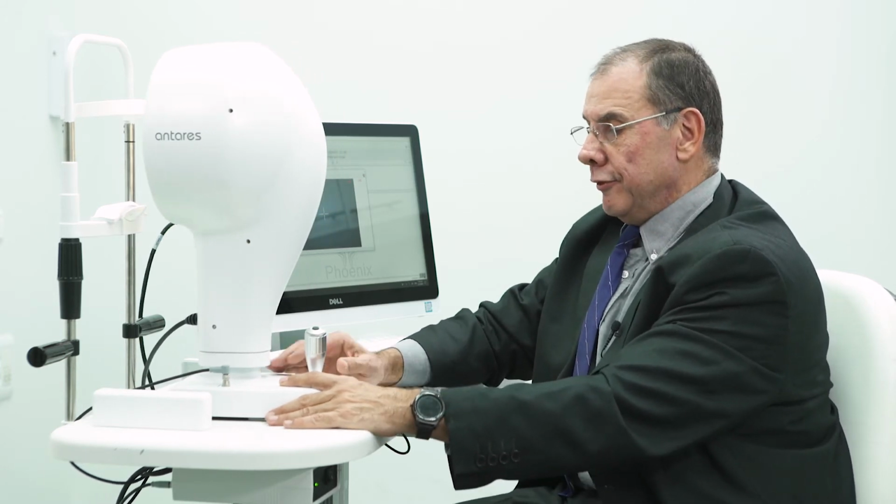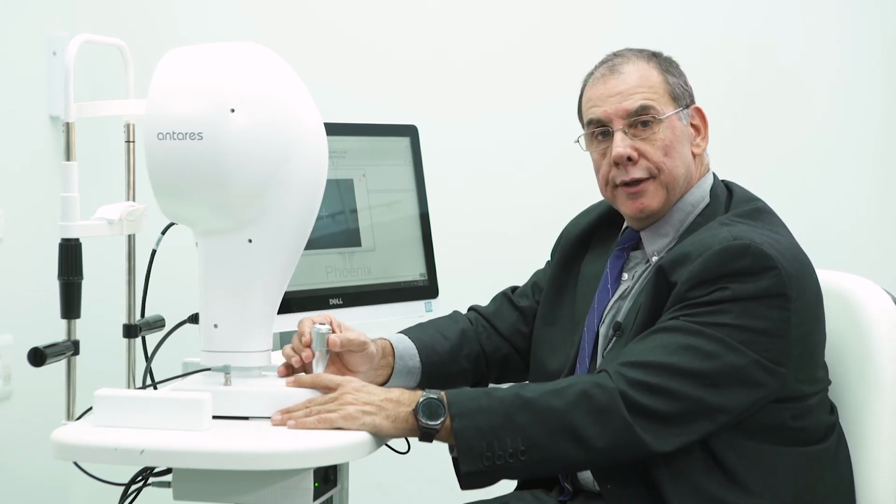What we'll do is take a patient and do an actual topography. I will show you the method of doing a capture. We're going to discuss it now, and then we'll do it in real time with a patient. What we have to do is use the joystick to center on the patient's cornea.